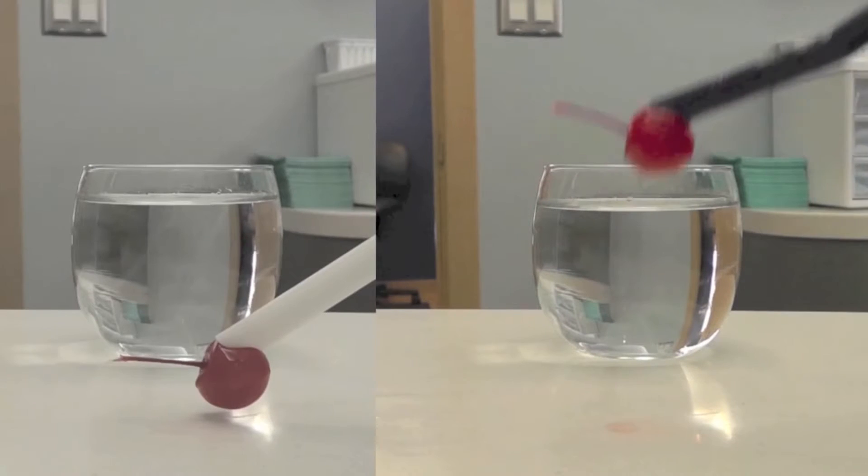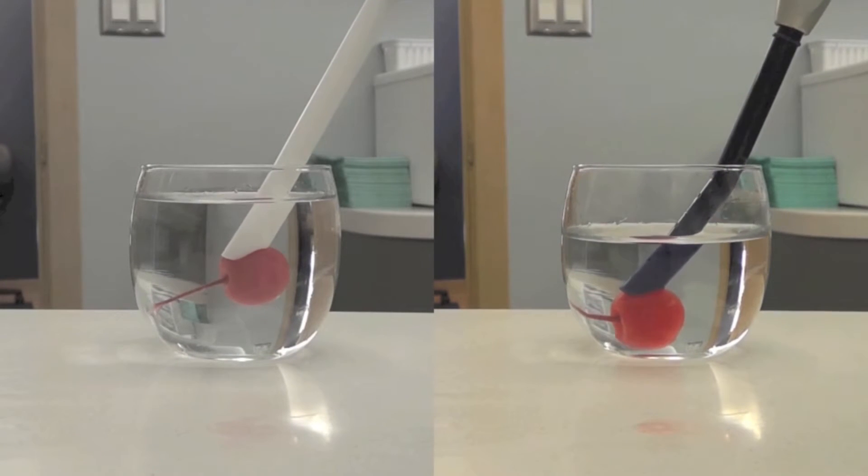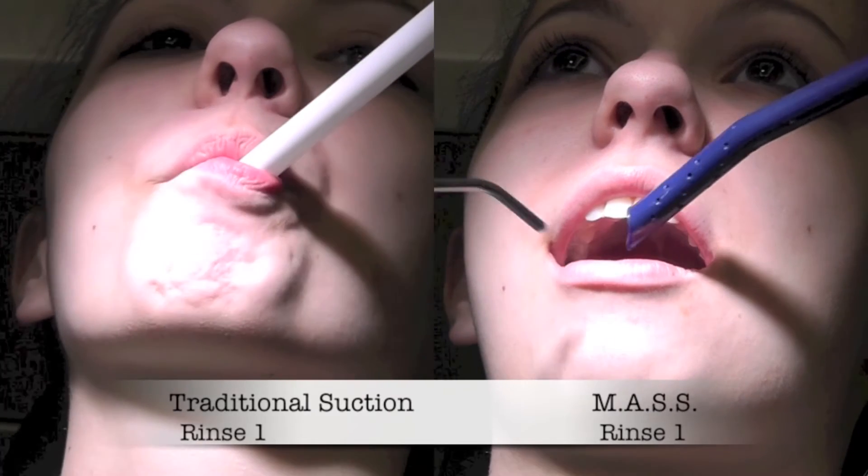After doing some mathematical calculations — because I'm a little bit of a nerd that way — I like to have control over the proportions. The ratio of holes on the side vents in proportion to the holes on the top vent allow you to have continual suction, and you are never going to get it stuck into the mouth, cheek, or tongue. Patients can actually close in on it, so you don't need slow-speed saliva ejectors technically. So there's a release — if it hits the cheek, it's going to continue to vacuum, because of the holes.